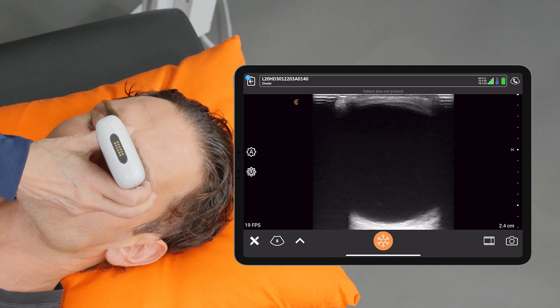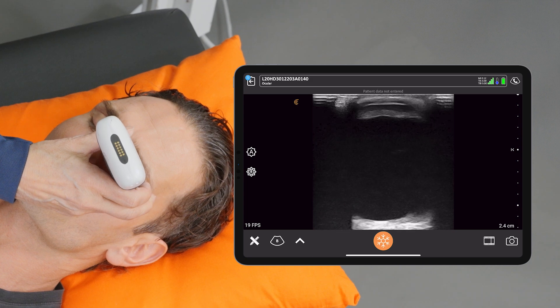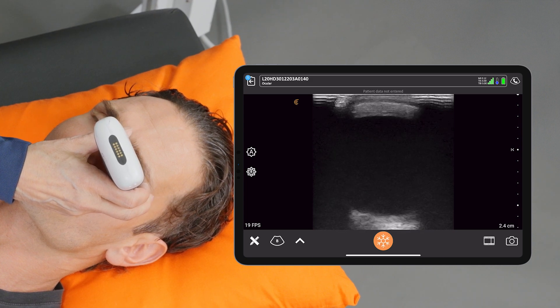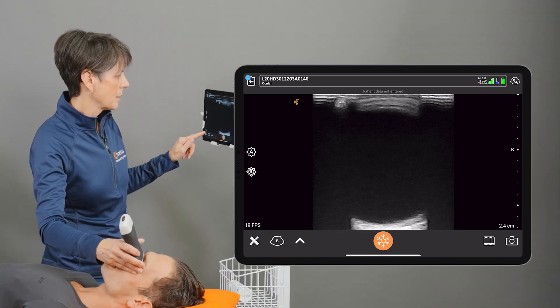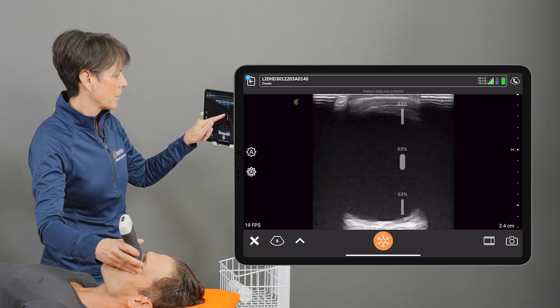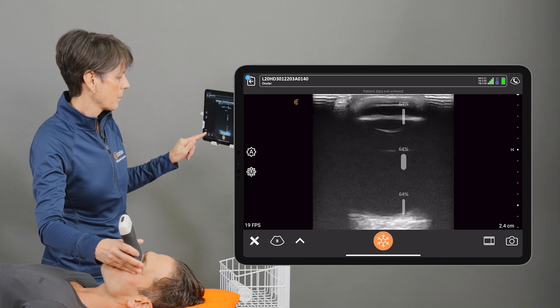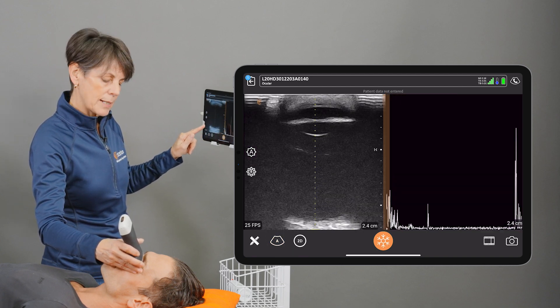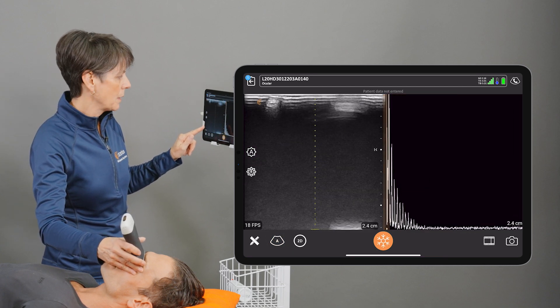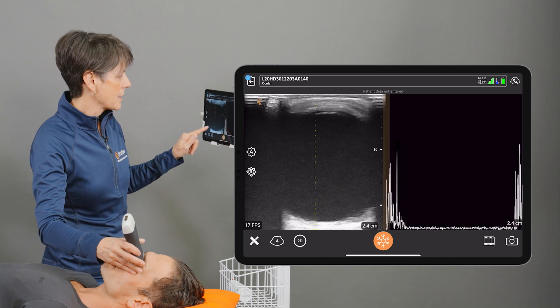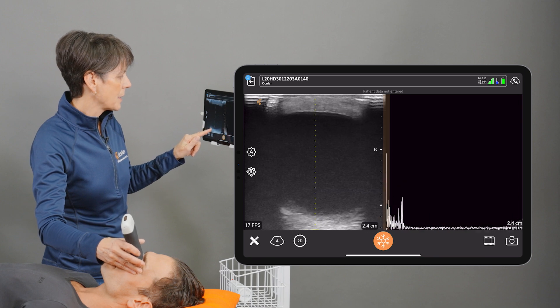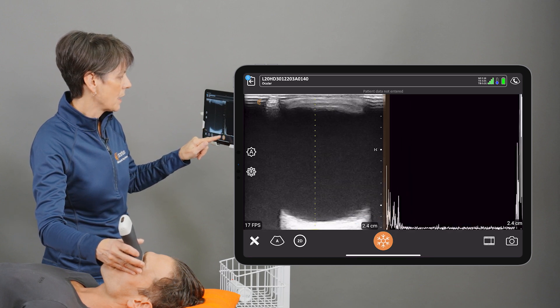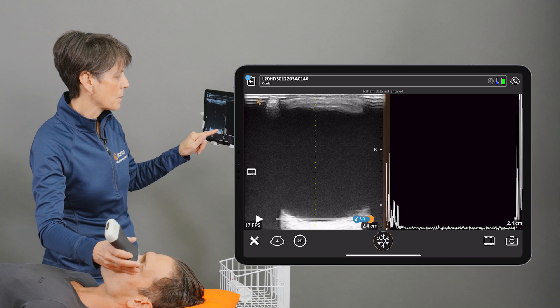Great. And so when I've got a good picture and I want to enter into A-Mode, I go into the Modes menu, select A-Mode, and we've got a nice side-by-side image of the structures of the eye, including the spikes.